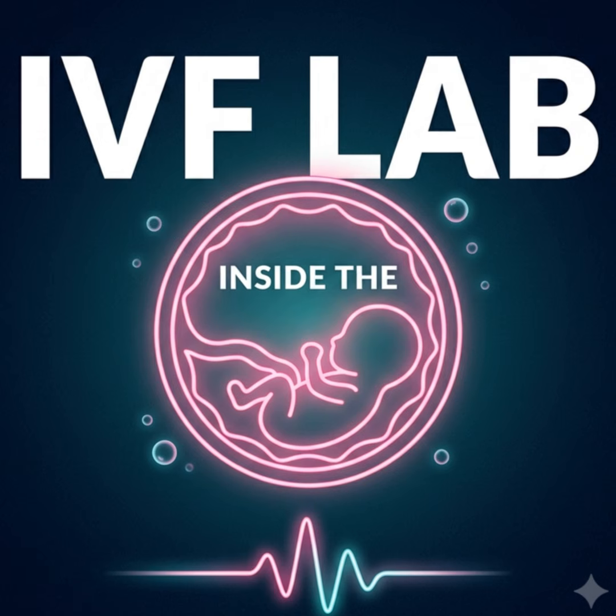Right. But just counting them isn't enough. They're also looking at the symmetry of those cells. Symmetry meaning like the size of them? Exactly. Biologically, when one cell divides into 2, those 2 resulting cells, the blastomeres, should be relatively equal in size. It shows an even distribution of the cytoplasm, which is the cellular fluid. And if they aren't symmetrical, if, say, one is huge and one is tiny? It's just that the cellular machinery that was pulling the cell apart wasn't perfectly aligned, which often correlates with chromosomal issues or a lower developmental potential.